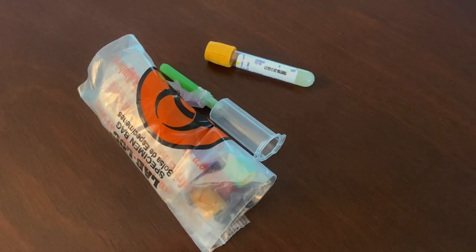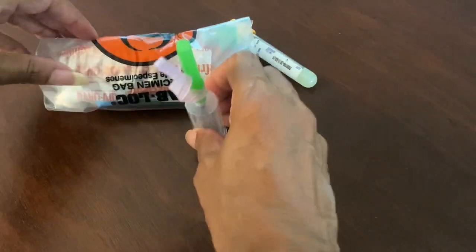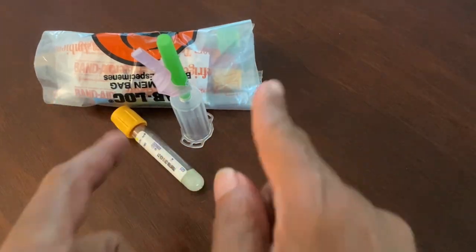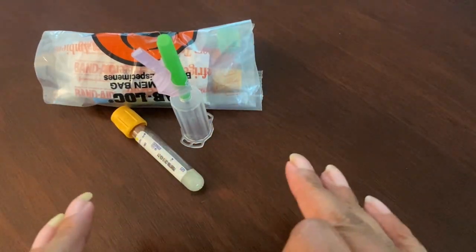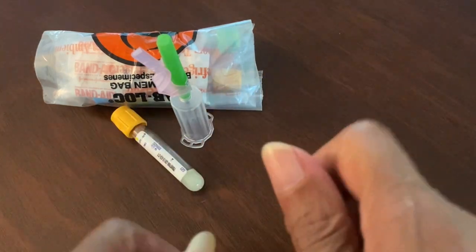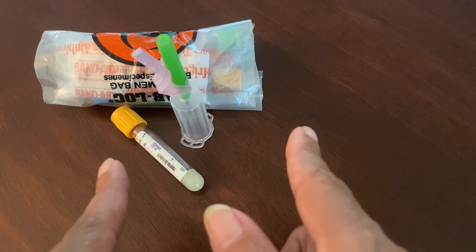Hey everybody, welcome back to the channel! You guys have been wanting a stick — we are gonna do a stick, because we are talking about redirecting. I want to give you guys a few tips because fishing is not fun when it comes to phlebotomy.